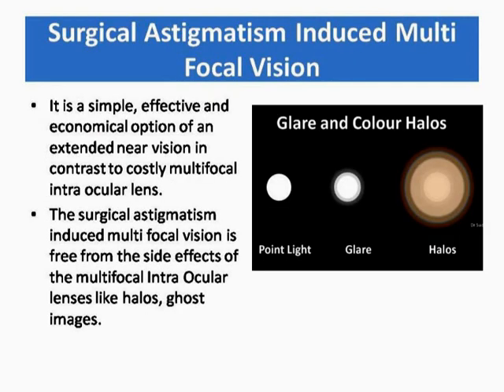It is a simple, effective, and economical option of an extended near vision in contrast to a costly multifocal intraocular lens. The surgical astigmatism-induced multifocal vision is free from the side effects of multifocal intraocular lenses like halos and ghost images.